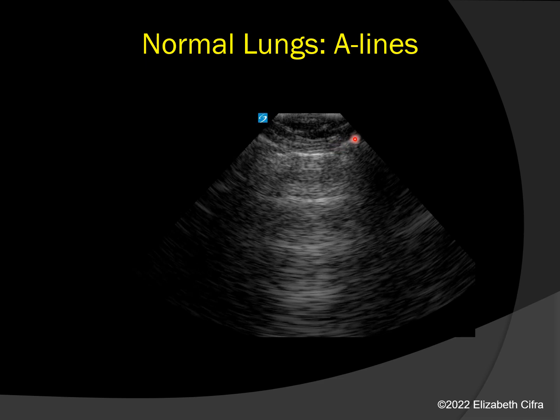First, we are seeing the ribs. The ribs are a thin line of brightness, hyperechoic. Remember, they are very dense structures, bones, so it is very reflective. And there is quite a bit of acoustic shadowing because of the bone. They would not be able to penetrate through the ultrasound beams, and therefore we get acoustic shadowing thereafter.